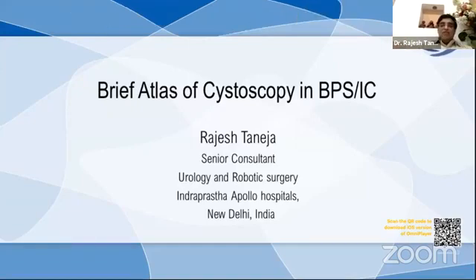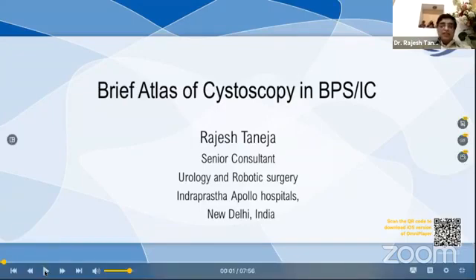This is a brief atlas of cystoscopy, presented as a video with an audio background. It starts now.